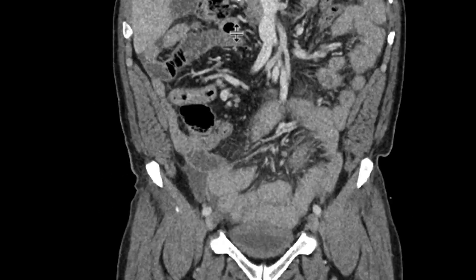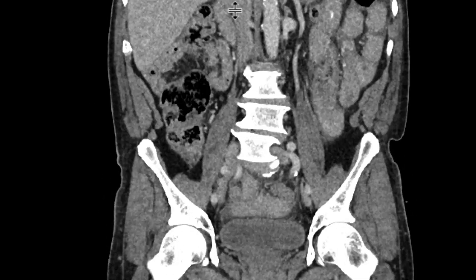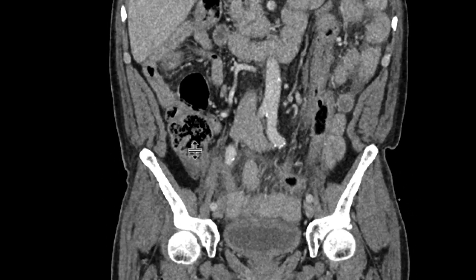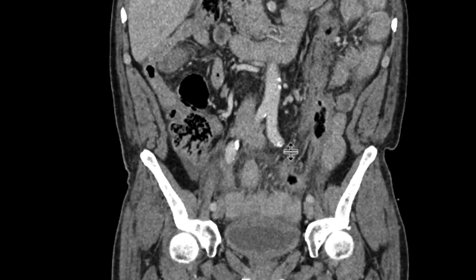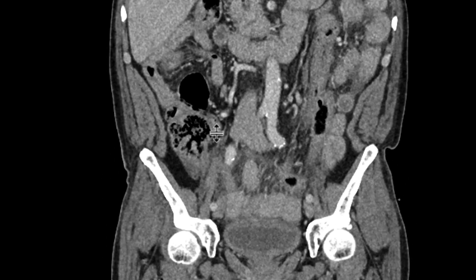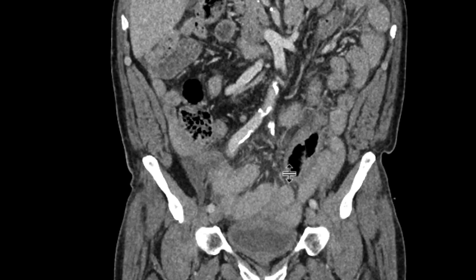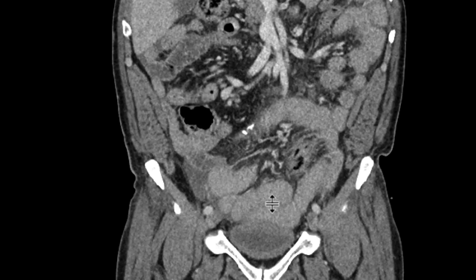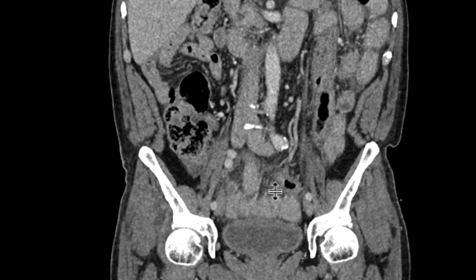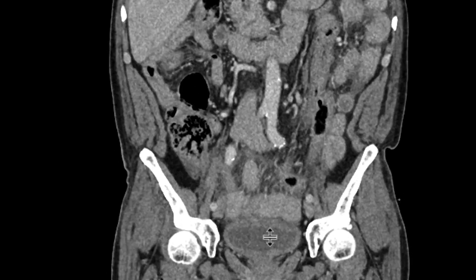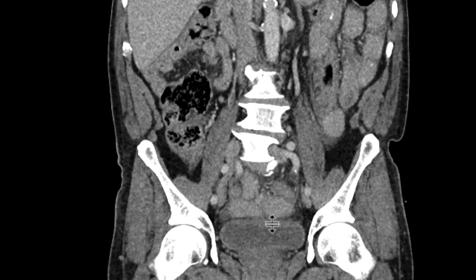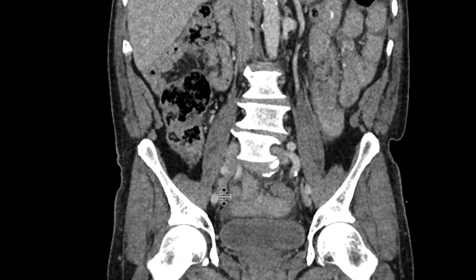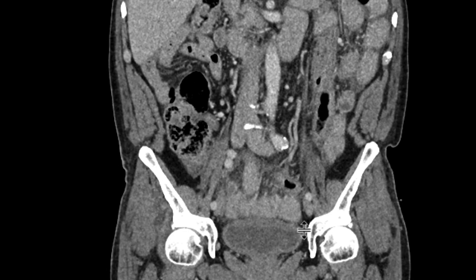Let's see what it looks like on the coronal images. This is the cecum again. Over here is the terminal ileum, so we know not to focus on that. We're looking at this structure coming from the cecum — thick-walled and tubular in shape. Looking at it in cross-section, it has a little bit of fluid in it, a very thick wall, and some inflammatory change.